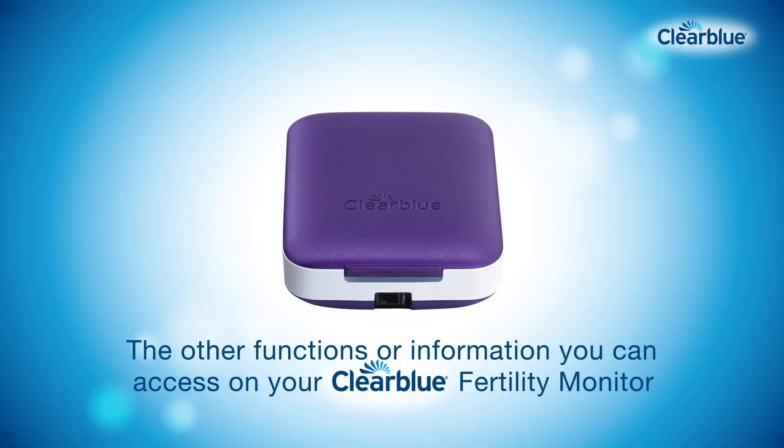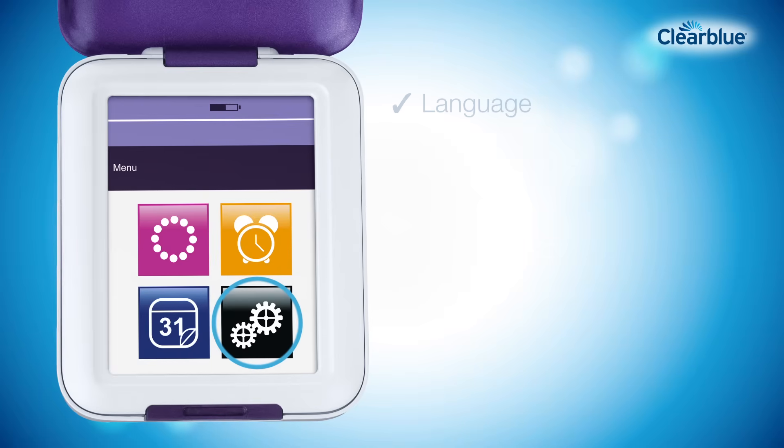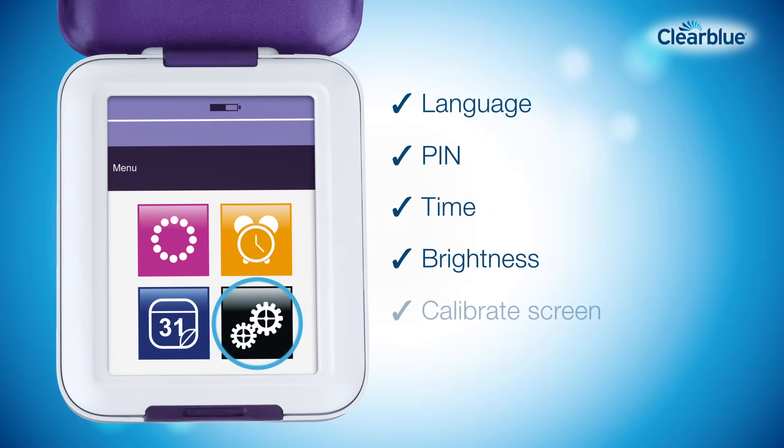Other functions you can access on your Clearblue Fertility Monitor include the alarm, which can only be set to sound during your testing window on test days. Your settings allow you to change the language, your PIN, the time, the brightness, calibrate the screen, and to reprogram your monitor.